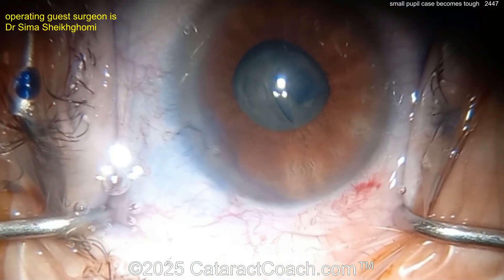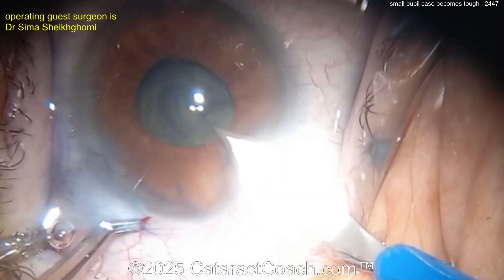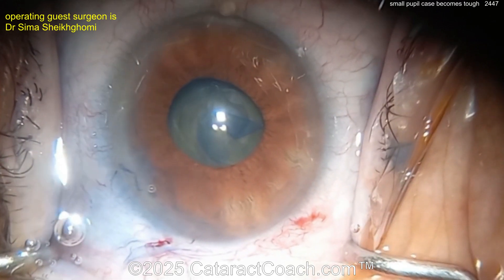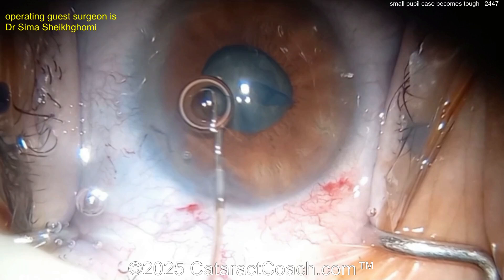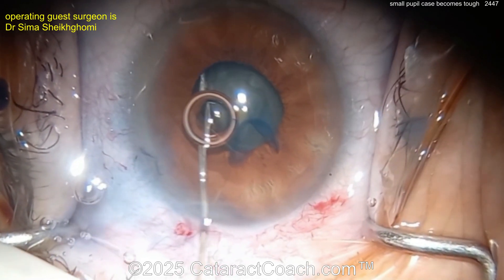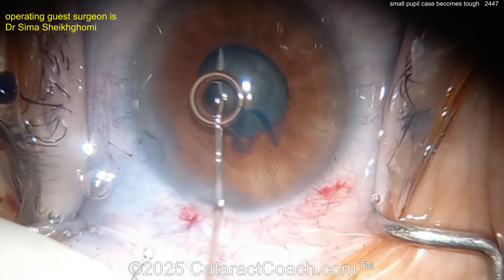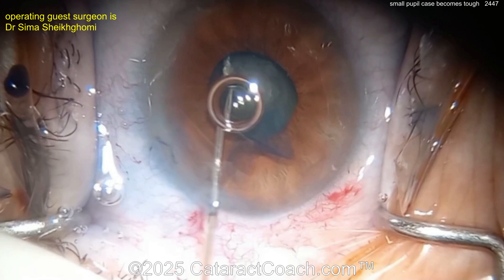Here comes the main incision with the keratome. Now making a paracentesis on the other side. I like to use a smaller blade to make the para — some surgeons use the same keratome and only go in partway, but the problem is it creates too wide a paracentesis.